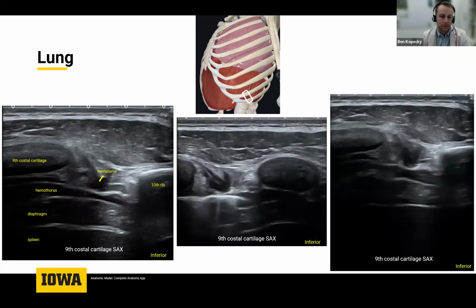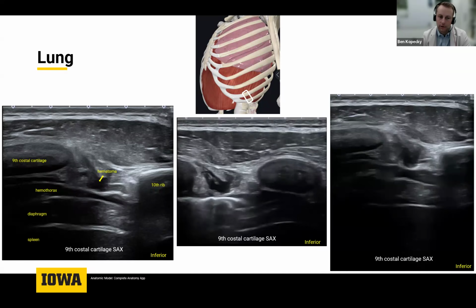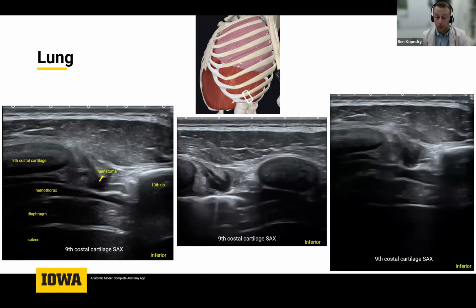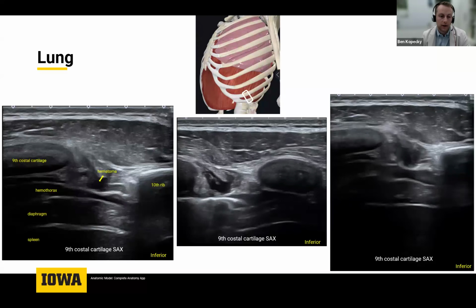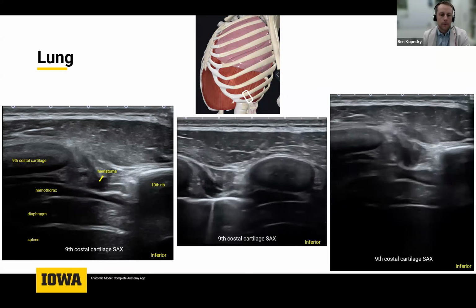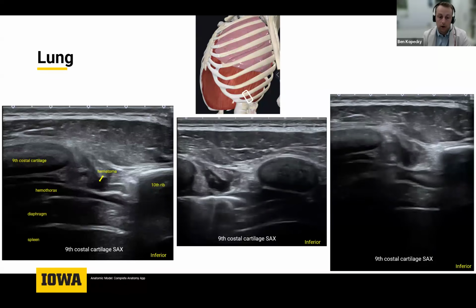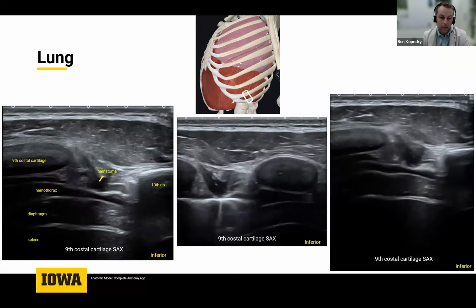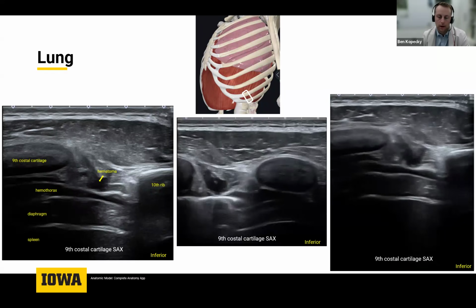So as the patient breathes, you can see here, there's this mobile anechoic area of fluid that's consistent with a small hemothorax. And so another very important evaluation here is to look for the presence of a pneumothorax. So keep your eye on that mobile hyperechoic line. That's the lung pleura moving with each breath, and a sliver of lung parenchyma deep to it in the bottom left corner of that middle video.